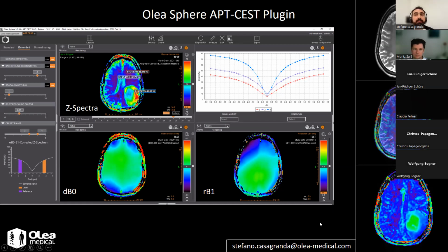So for example, sometimes the offset values are not present in DICOM. So you can add a TXT file in our server to link these offset values to your sequence. Or there are ways to tune the spatial smoothing to do advanced stuff.